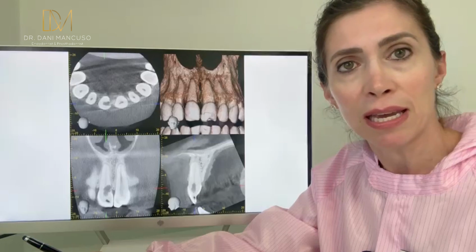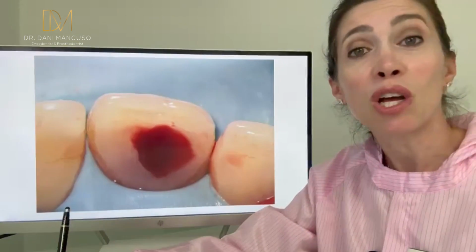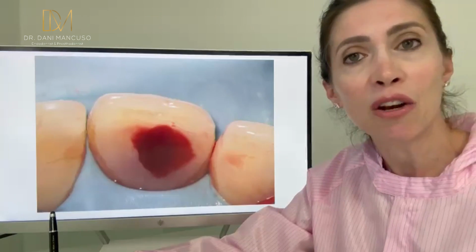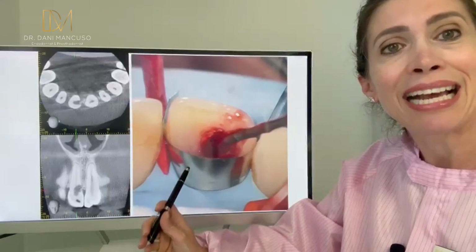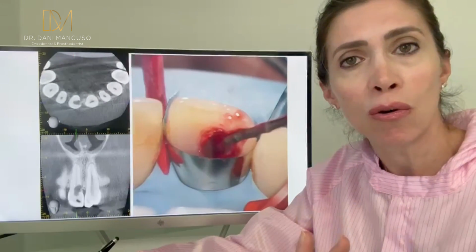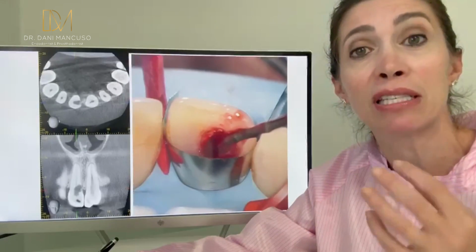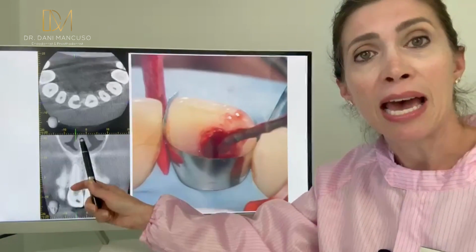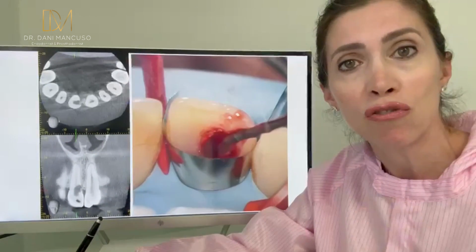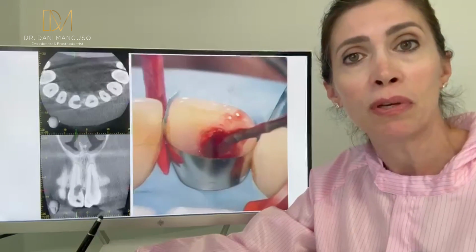So what to do in those cases? The first thing you want to do is to access the tooth. But when you access, the problem is it starts to bleed quite a lot and you cannot see what's going on. So instead of panicking, just go in there and clean. You can use a slow spheric carbide burr, just to clean that cavity without perforating the root, because that area is so thin, and the last thing you want to do is to destroy that, because that will work as a scaffolding for you. You need that to build the wall.